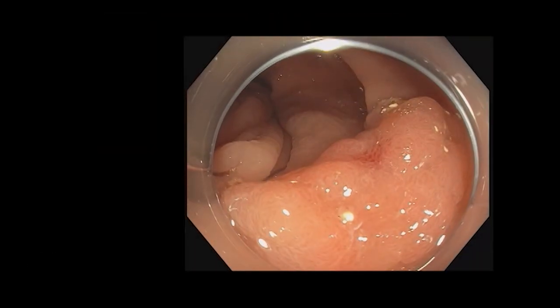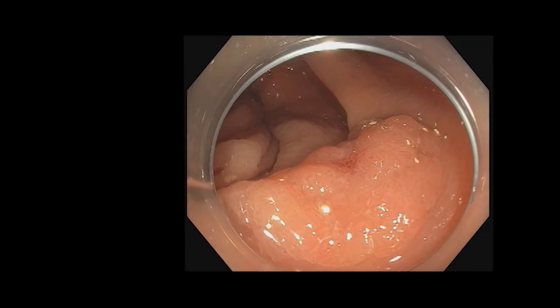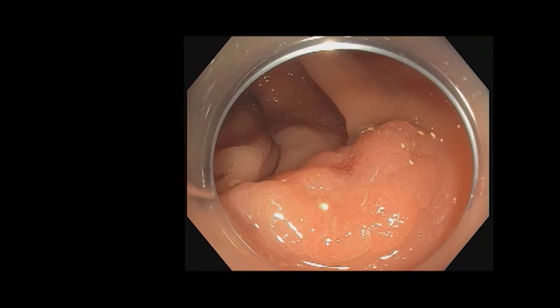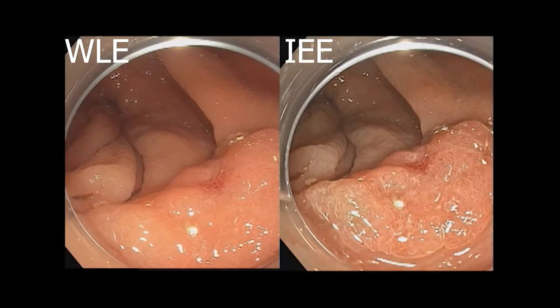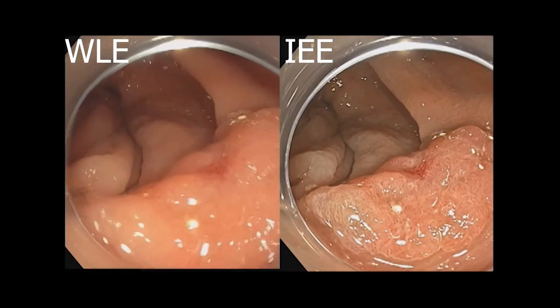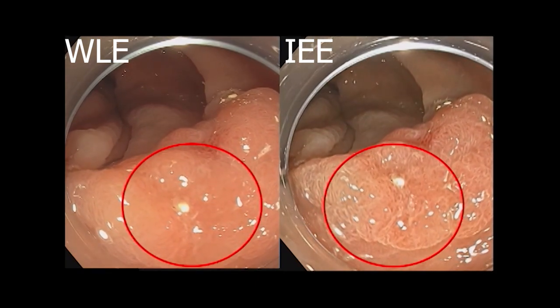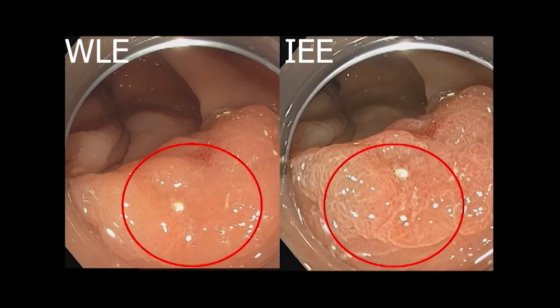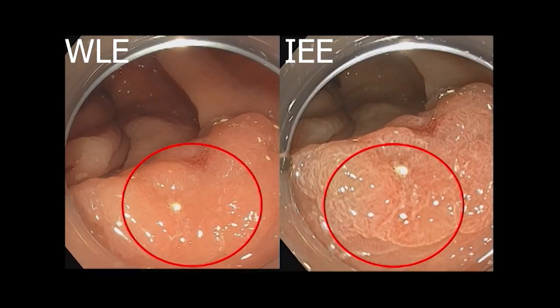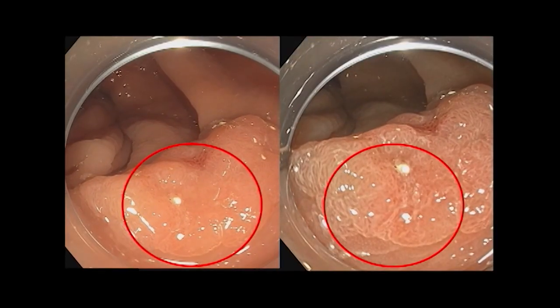The stark contrast and level of increased detail is more apparent when we look at the real-time video of this lesion. Comparing side by side to the white light input, the enhanced image facilitates the recognition of an area concerning for submucosal invasion. This led to the decision to perform endoscopic submucosal dissection as opposed to mucosal resection. The final pathology was consistent with superficial adenocarcinoma without high-risk features.